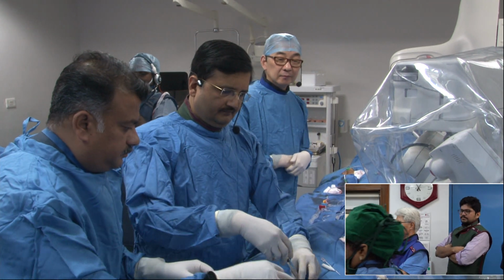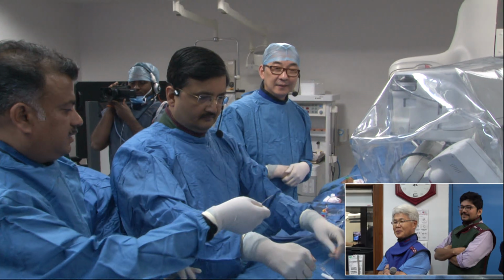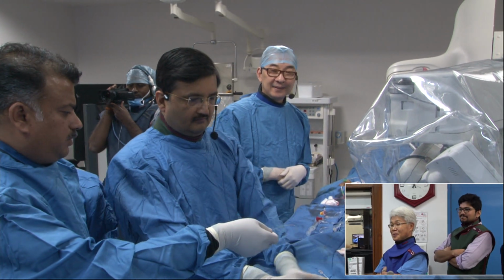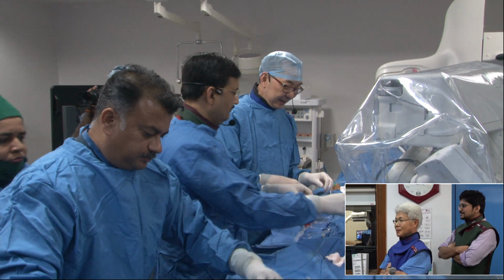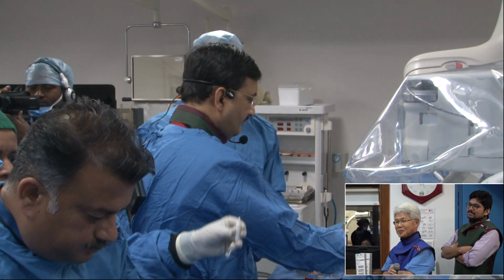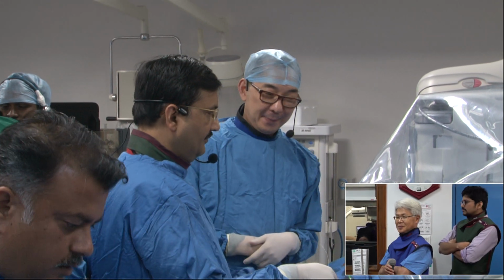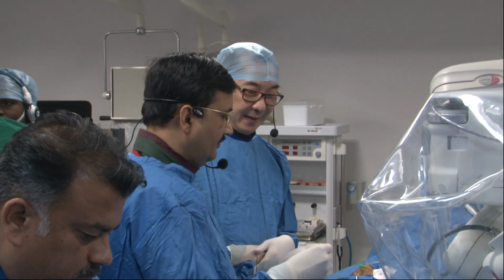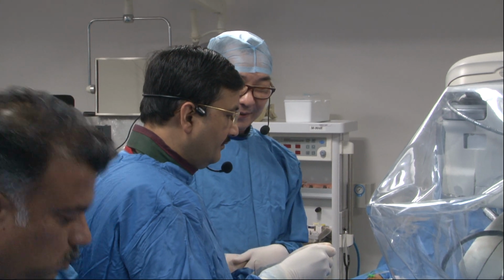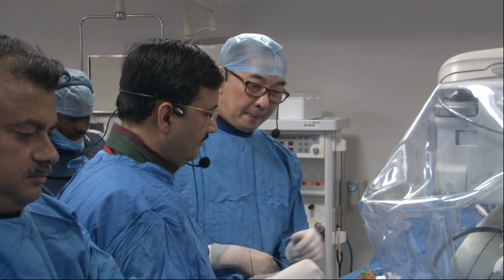I think OCT is much better than IVUS. We will see the result of OCT and IVUS, and the pictures will speak on their own in 10 minutes. Well, with IVUS we can use less contrast. It very much depends on what you're using your modality for. For left mains, I would say IVUS for assessment of the degree of calcium thickness. For everything else, I would use OCT.